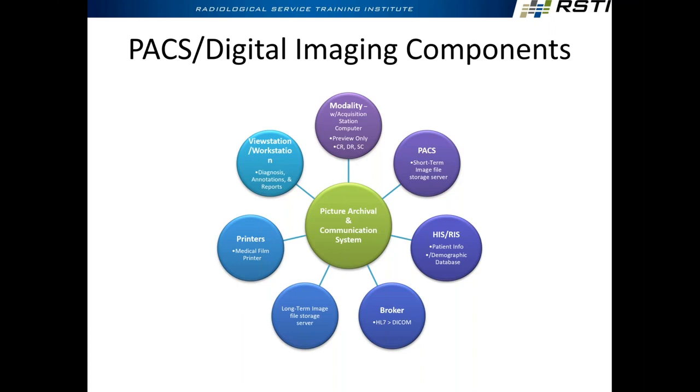It's still DICOM. Everyone thinks of DICOM as an image, like CT or X-ray. But dose reports are a good example. They're DICOM files. That reporting is standardized, but it still gets into PACS. Does that kind of make sense? Does it have an image?